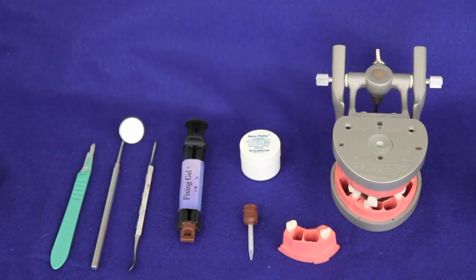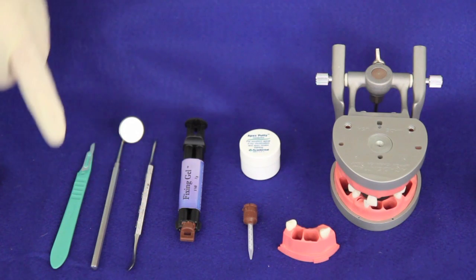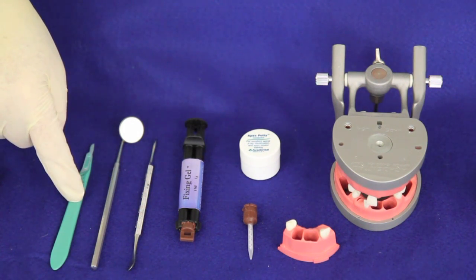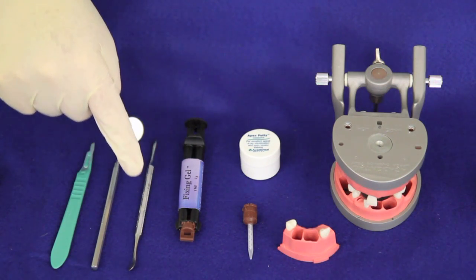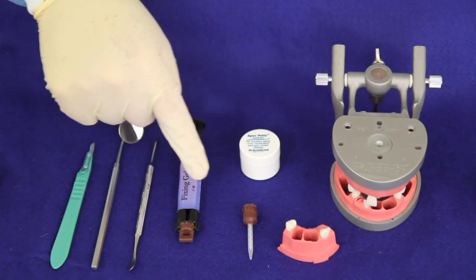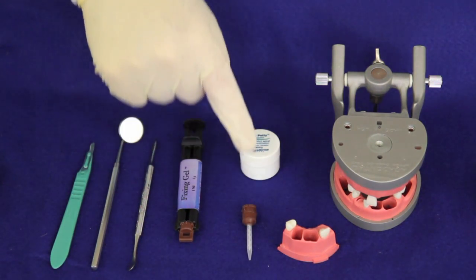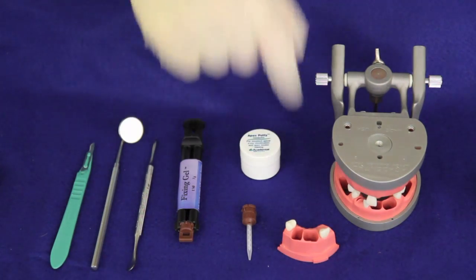These are the supplies that we need to mount a tooth in one of the removable segments. A sharp disposable scalpel, dental mirror, wax spatula, No. 7 wax spatula, fixing gel, the tip for it, apex putty, and the segment itself.